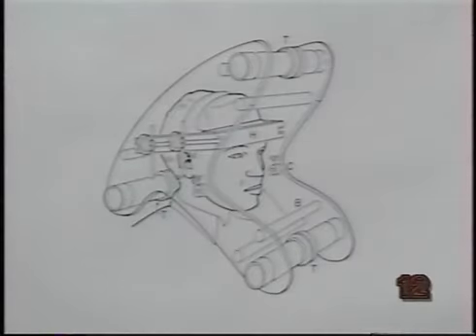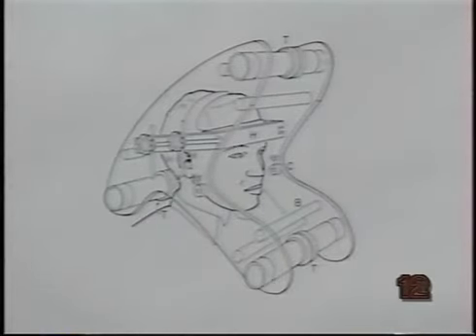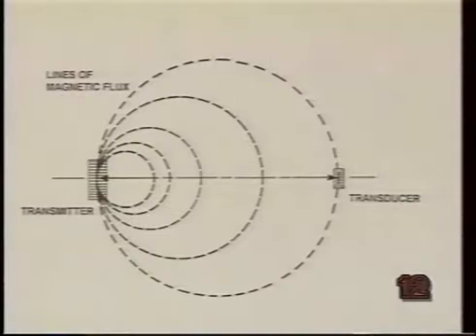In the EMMA system that we developed and use at MIT, 3 transmitter coils are held in a transmitter assembly, with the coil axes perpendicular to the midline plane. The transmitter assembly is positioned on a subject so its midline coincides with the mid-sagittal plane. Each transmitter is excited by a sinusoidal signal at a different frequency, between 60 and 80 kilohertz, generating an alternating magnetic field with a strength that decreases in proportion to the cube of the distance from the transmitter.